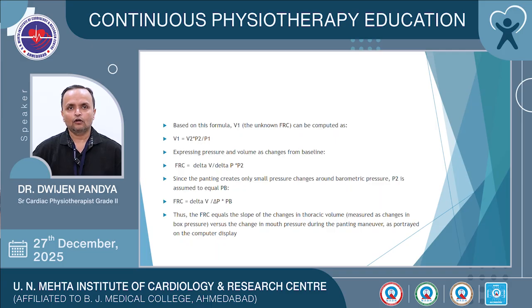Expressing pressure and volume as changes from baseline, the FRC will be delta V divided by delta P multiplied by P2. Since the panting creates only small pressure changes around barometric pressure, P2 is assumed to be equal to PB. So the FRC will be equal to delta V divided by delta P multiplied by PB. Thus the FRC equals the slope of the changes in the thoracic volume, measured as changes in the box pressure, versus the changes in the mouth pressure during the panting maneuver as portrayed on the computer display.